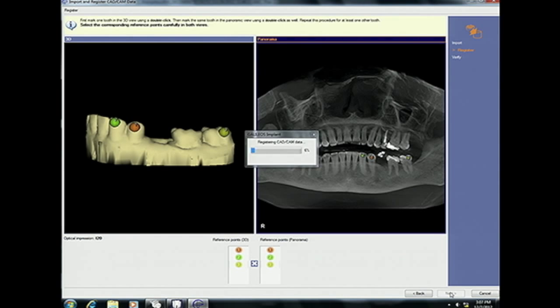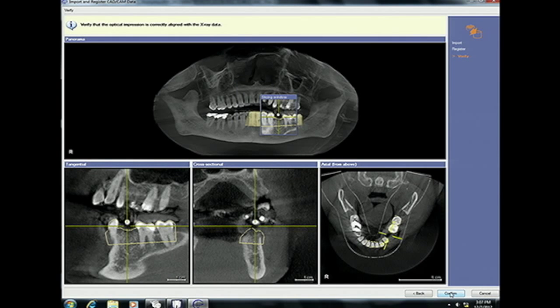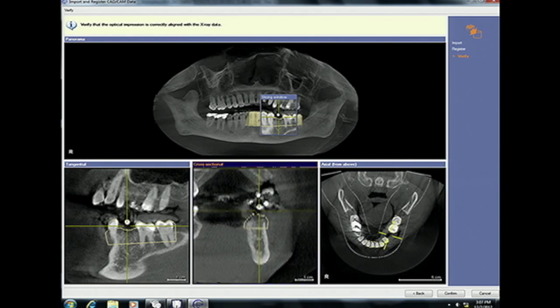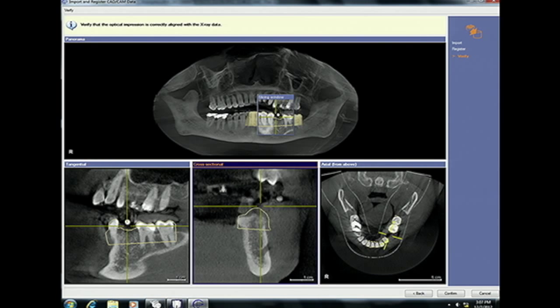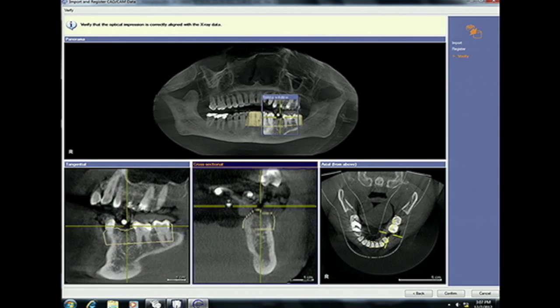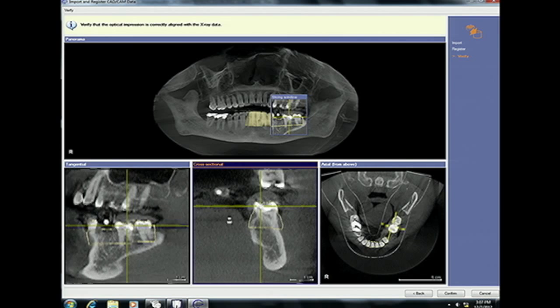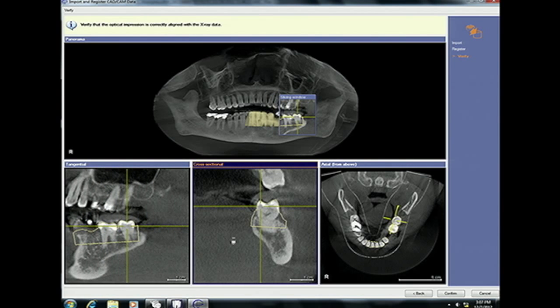I'm simply going to click Next and let the algorithm match the datasets together. The very next screen requests us to verify that the optical impression is correctly aligned with the x-ray data. The way we do this is we scroll into the cross-sectional view and scroll through the volume using that slicing window, making sure that the yellow outline of the CAD-CAM data is matched perfectly with the clinical crown of the radiographic dataset.